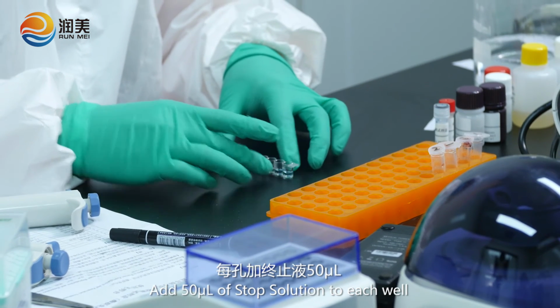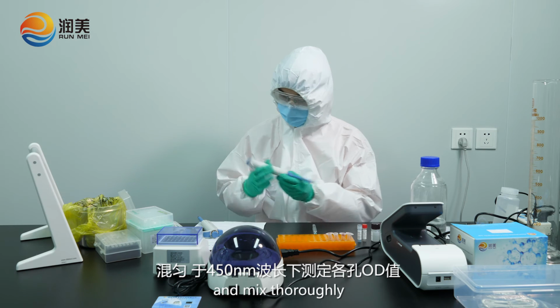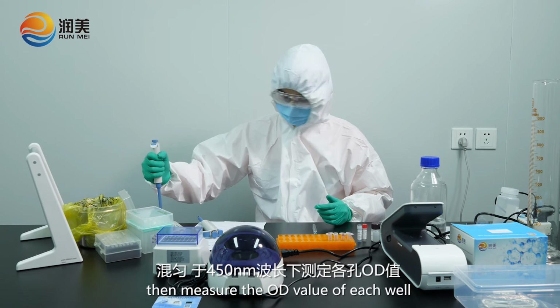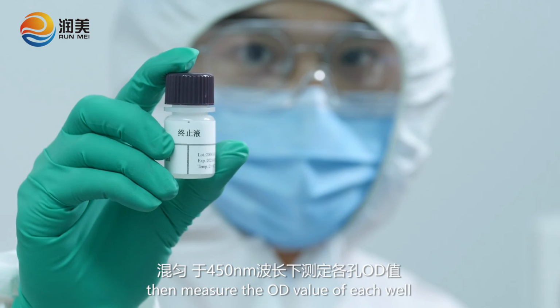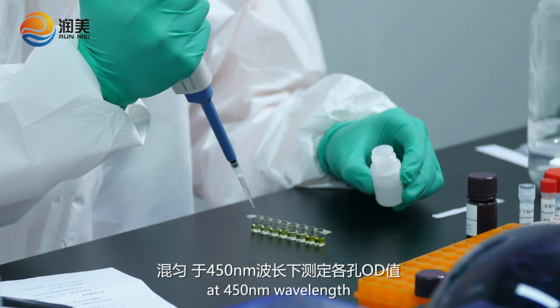Add 50 microliters of stop solution to each well and mix thoroughly. Then measure the OD value of each well at 450 nanometer wavelength.